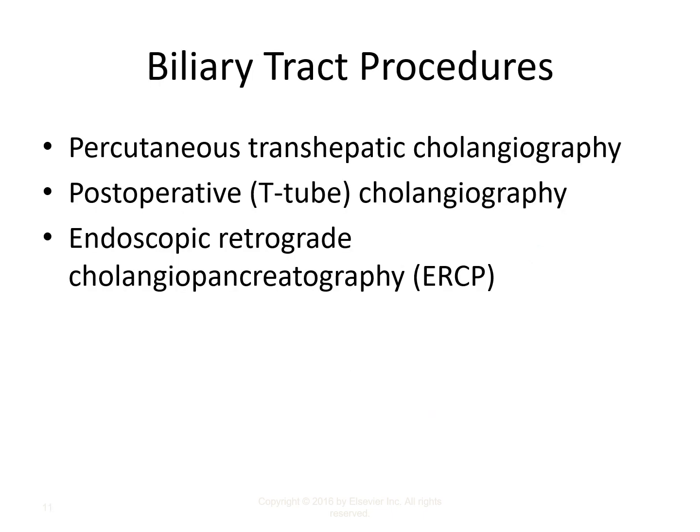All right, so in order to visualize the gallbladder and the biliary system, there's three primary procedures. Now, they might dream up additional procedures and you might encounter additional procedures, but for conventional contrast assisted X-ray technology, percutaneous transhepatic cholangiography, that is likely to happen in CT more than it is fluoroscopy, but it's within the realm of possibility. You can get an old school radiologist that wants to do it in the fluoro room and then transfer them to CT post injection.